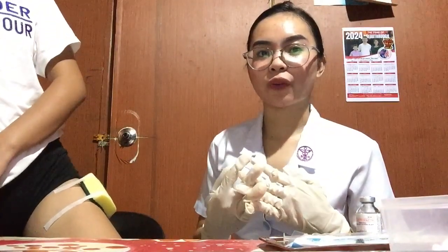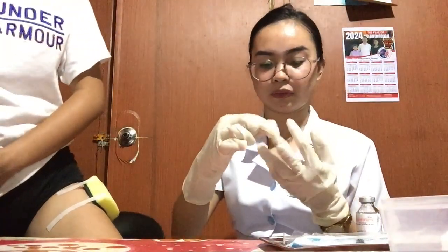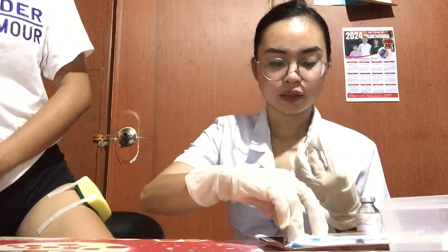Then discard, and prepare the syringe for injection. Before that, transfer and hold the swab between the third and fourth fingers of your non-dominant hand in readiness for needle withdrawal, or position the swab on the client's skin above the intended site. So now prepare the syringe for injection, and then remove the needle cover and discard without contaminating the needle.